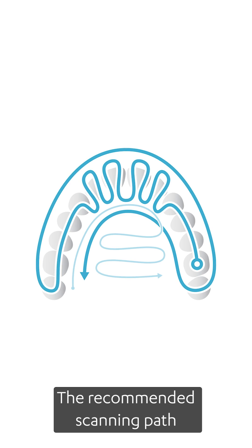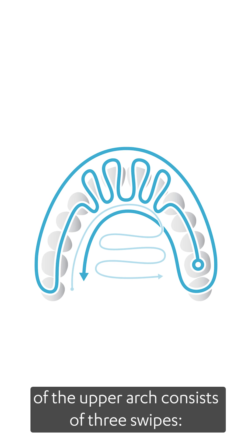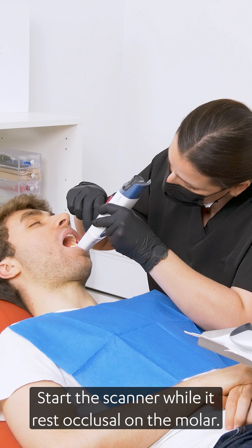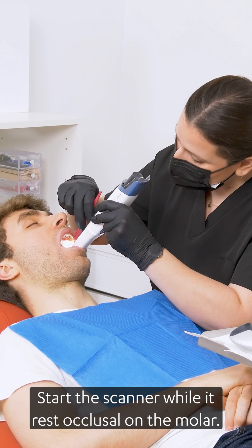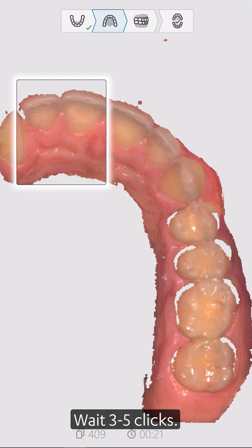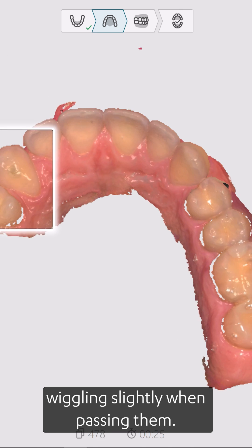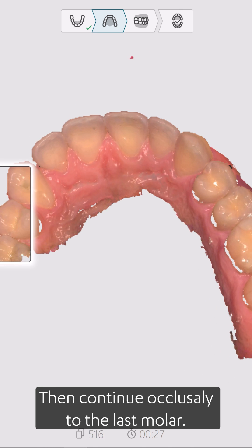The recommended scanning path of the upper arch consists of three swipes: occlusal, buccal, and palatal. Start the scanner while it rests occlusal on the molar. Wait three to five clicks, then move toward the centrals, wiggling slightly when passing them. Then continue occlusally to the last molar.